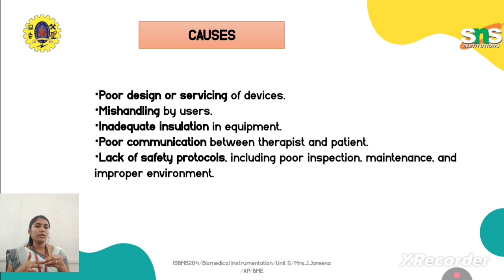So the equipment should have adequate insulation material, that is a non-conductive material, so that when a person knowingly or unknowingly touches that machine, there is no chance for the person to get the shock.